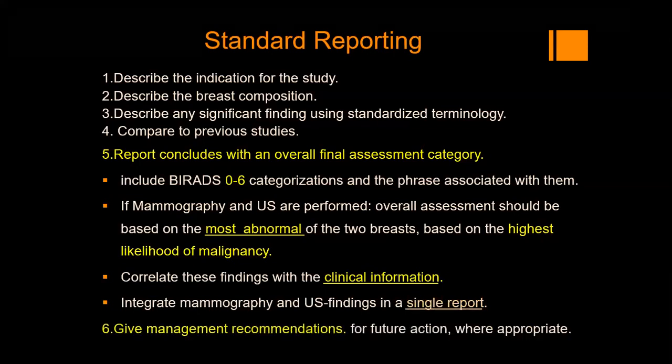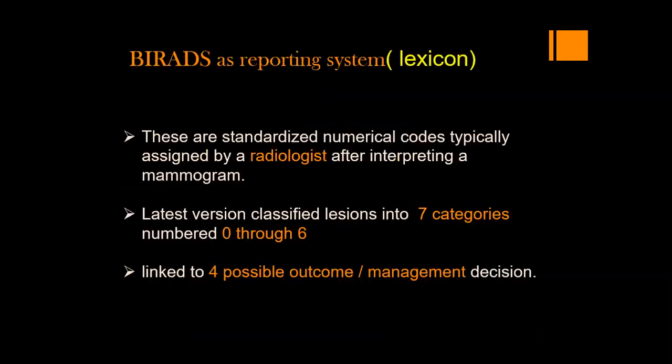Then we have to give management recommendations according to the BIRADS category we conclude to, for the management of future action where appropriate.